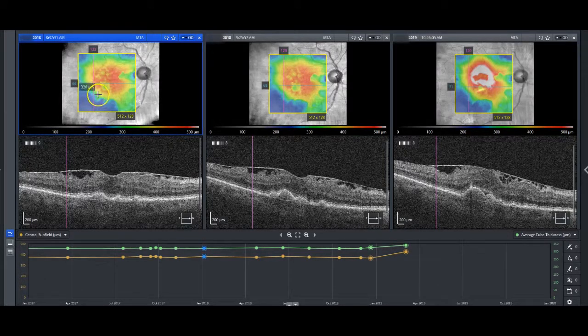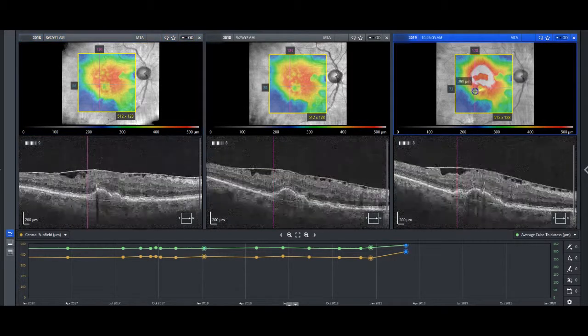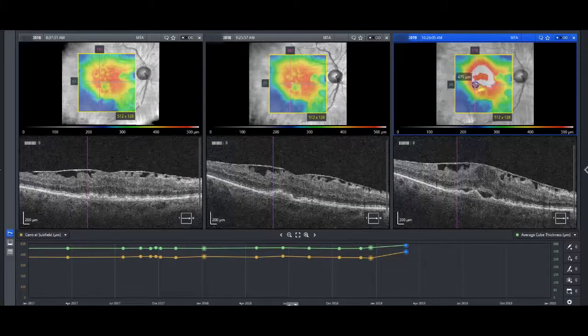Now, for those of you that were cheating and looking ahead to the right side of the screen as I was scrolling, you're going to see that when the patient came in on March 4th of 2019, the story was quite different. She had been noticing a slight decrease in vision in her right eye for a couple of weeks. And what you can see as you look at the image is you still see that epiretinal membrane, but look at the difference now. There's your epiretinal membrane, and now you've got not only retinal thickening, but you've got the start of early intraretinal fluid. You can note that by the alteration in the pixel color. So these are a little bit darker black here as opposed to that uniform gray.